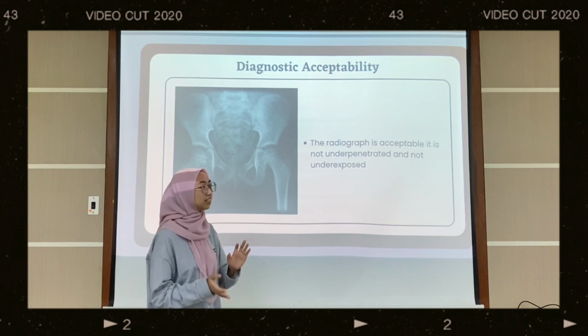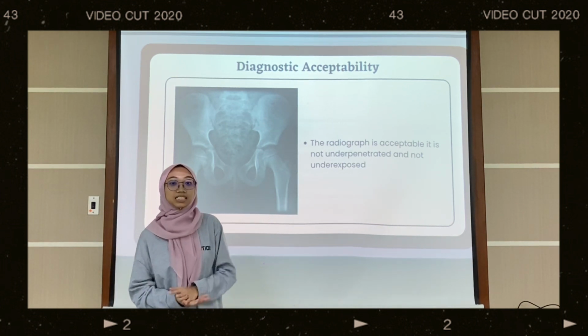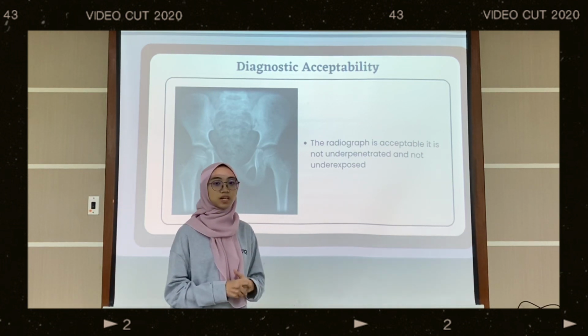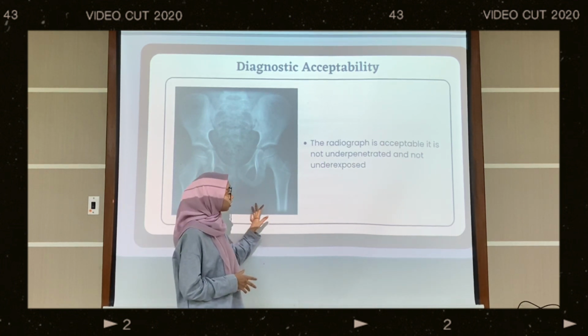And yes, the last one, diagnostic acceptability. This radiograph is acceptable because it is not underpenetrated and not underexposed. So it will qualify as a good radiograph we can use.